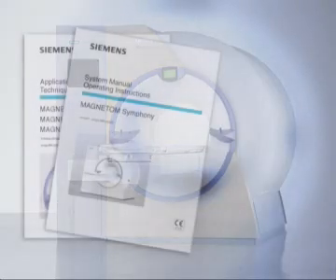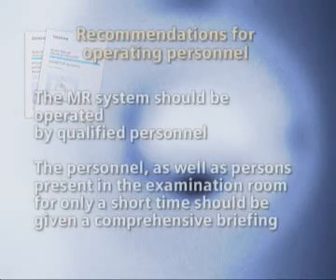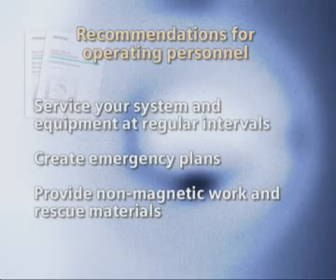Create emergency plans that describe the measures the patient, personnel, and rescue workers should take in response to potential dangers. Conduct regular emergency exercises with groups. Provide precise documentation of the emergency. Provide non-magnetic tools for cleaning, service, and emergency personnel.